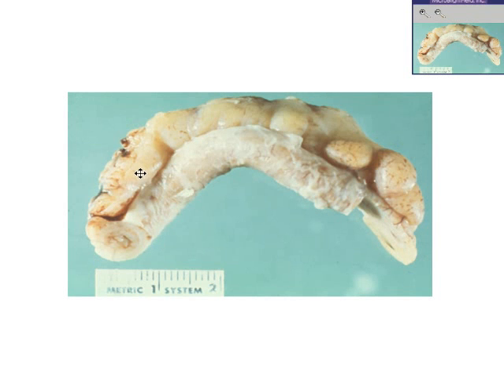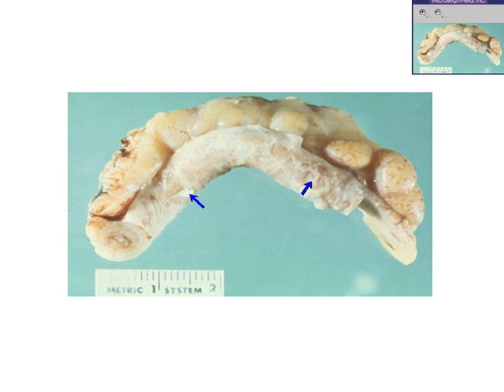Now we're going to finish up on our third and final slide on acute appendicitis. Here is a gross specimen. This one does not look as red as the first one because it's been fixed in formalin. The fibrin in the native unfixed state may look very red, but after fixation it takes on a creamy white colored appearance. These arrows show the creamier, whiter areas — that's just about pure fibrin.